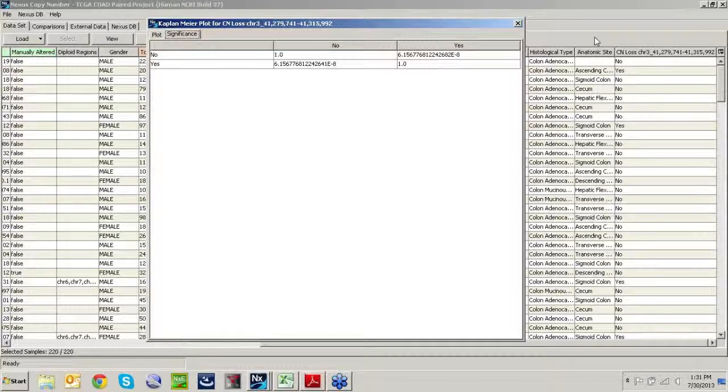We can also use more direct methods, like the survival predictive power tool, to identify statistically significant regions which affect survival. And then we can use that one-click Add as Factor button to generate a factor and get our Kaplan-Meier curve.